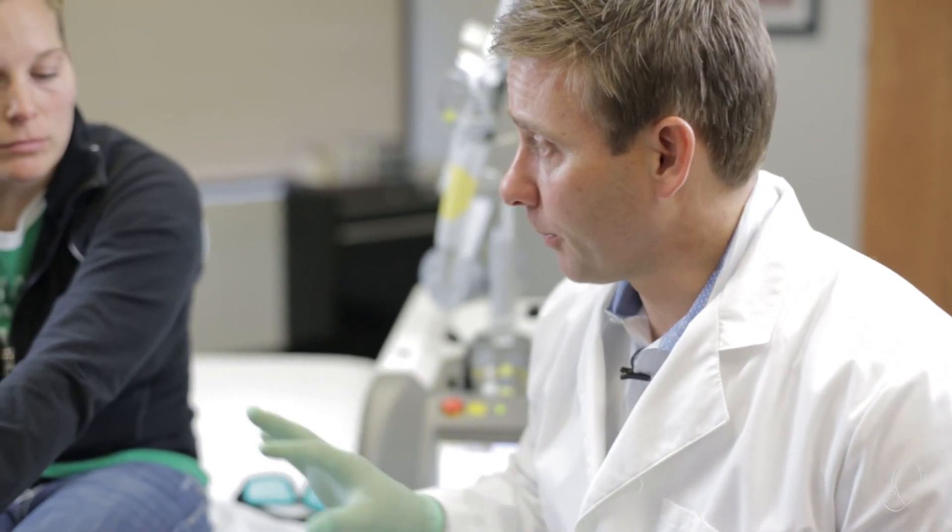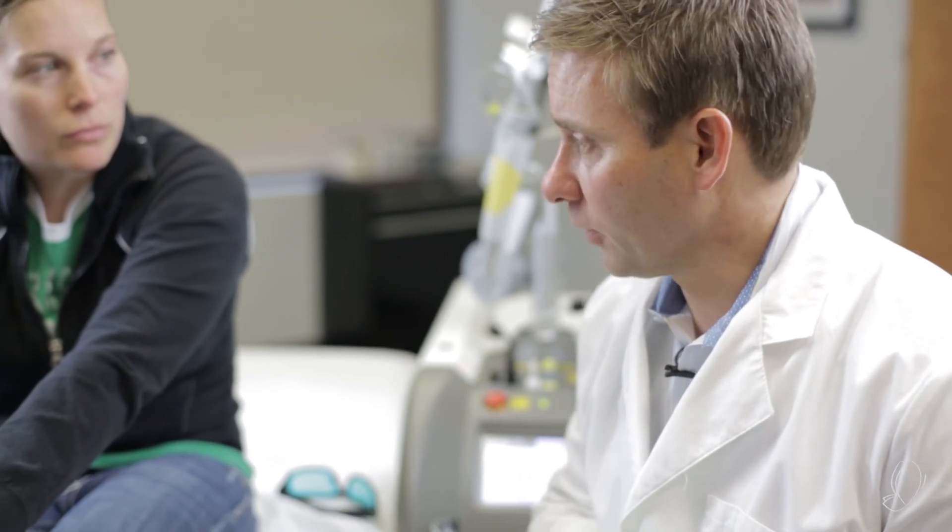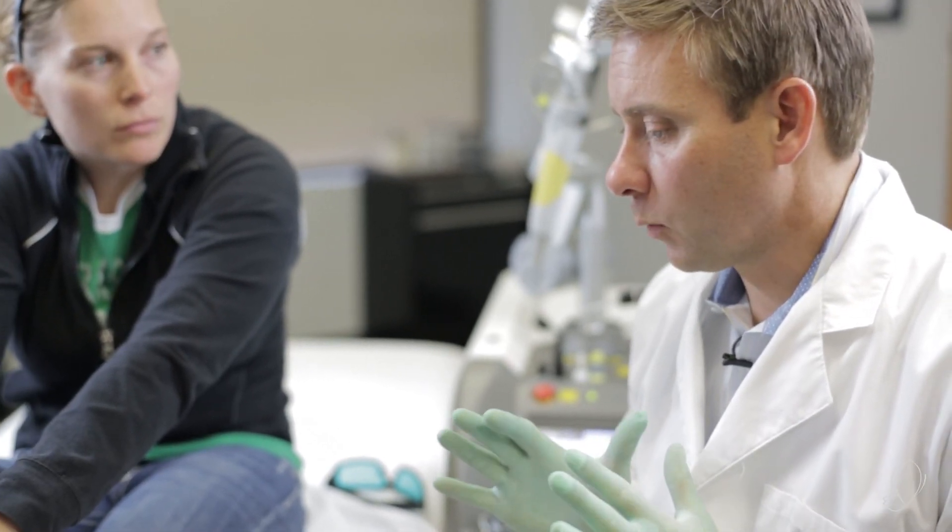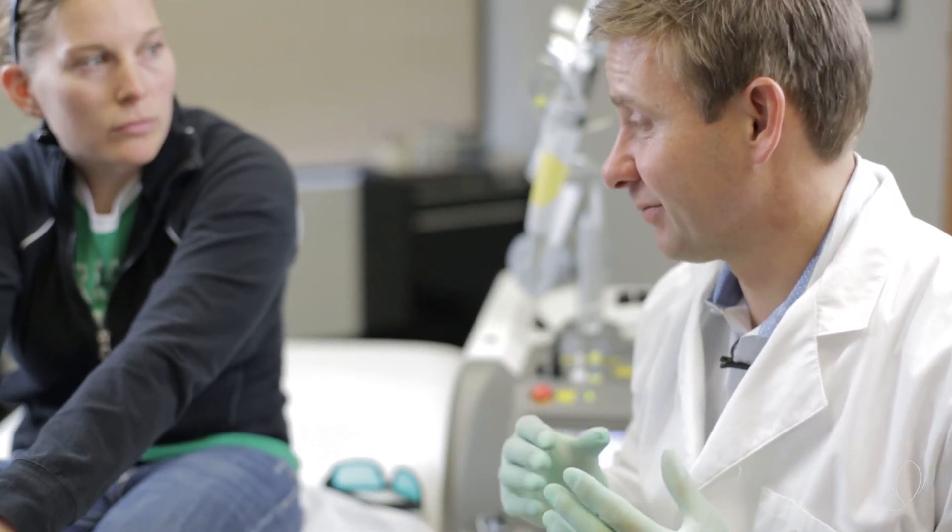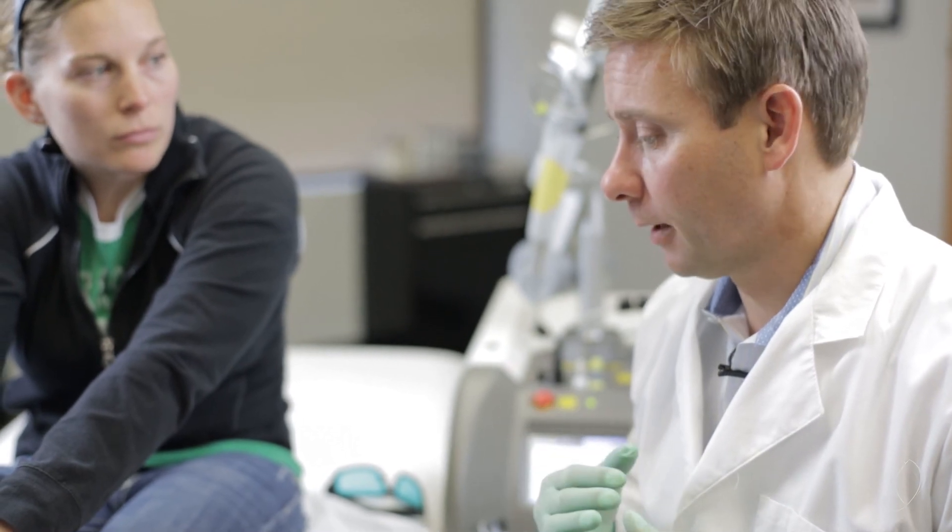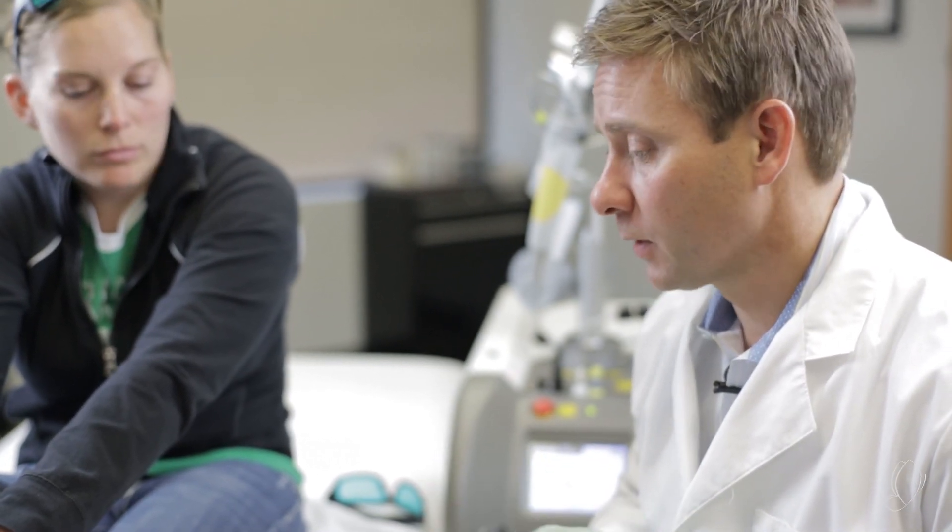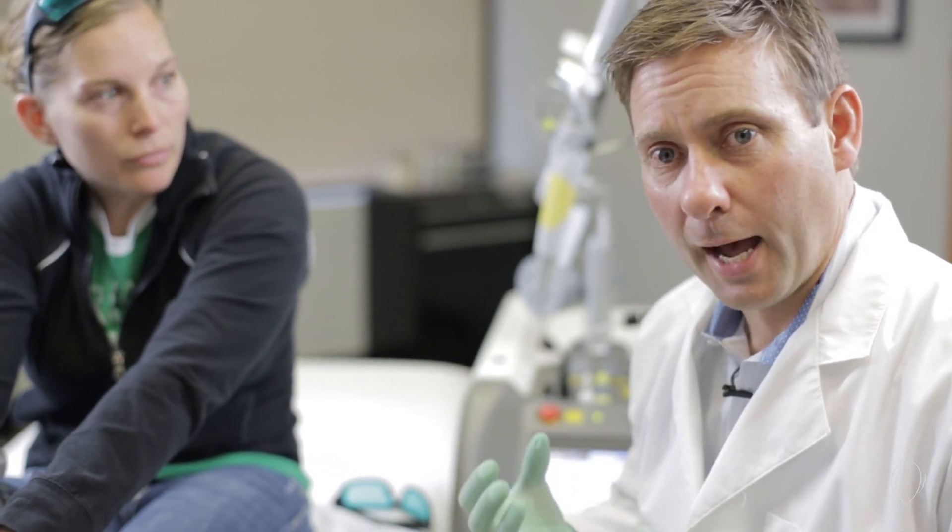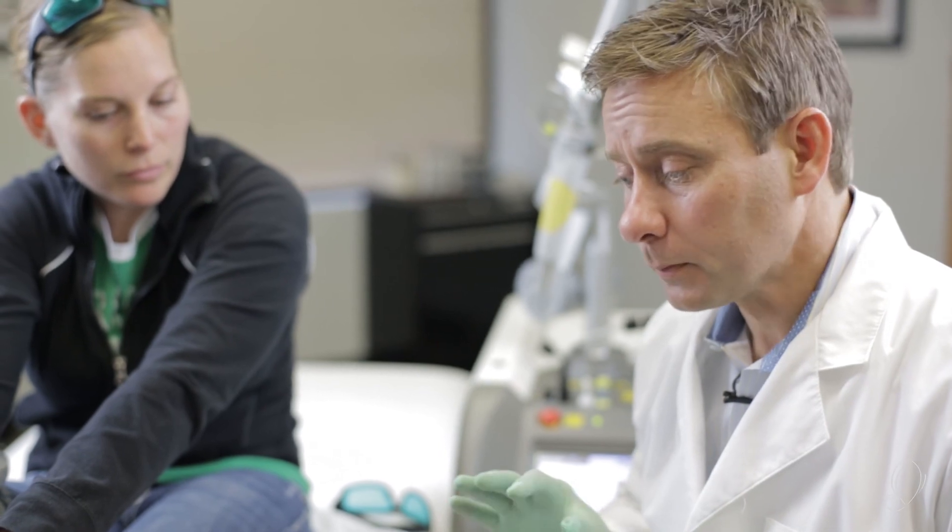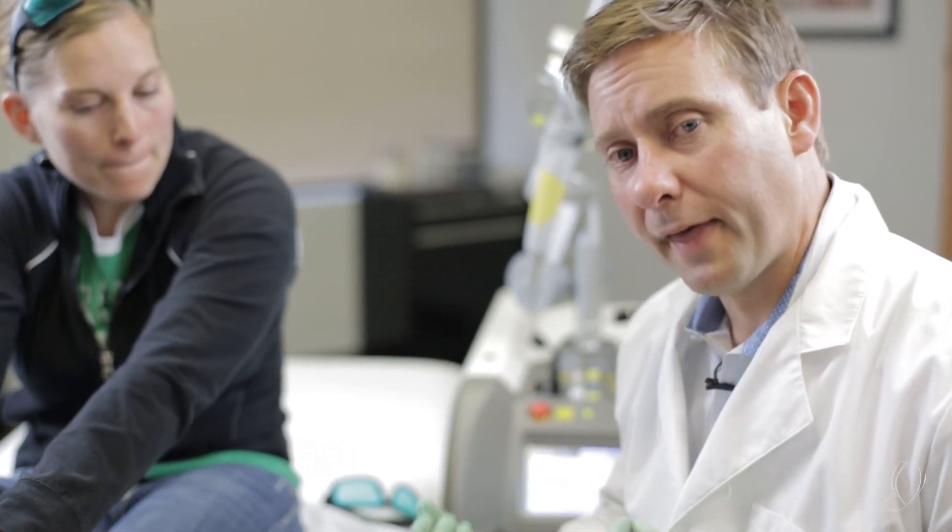Now from a post-care standpoint, we'll put some polysporin on this. We don't want you to be in a hot tub tonight. We don't want you to be in the sun for the next few days. One of the benefits of our technology is the lenses and the optics in our OptiBeam technology that really allow us to give a good treatment without breaking the skin. But nonetheless, you have put laser energy into this. We want to treat it carefully.